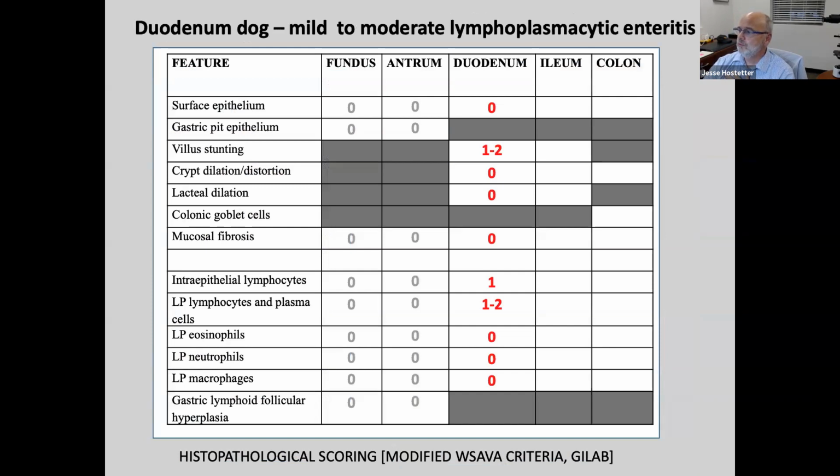This is how I scored this one. Quite a bit different than the way I did for the first sample, first case we looked at.